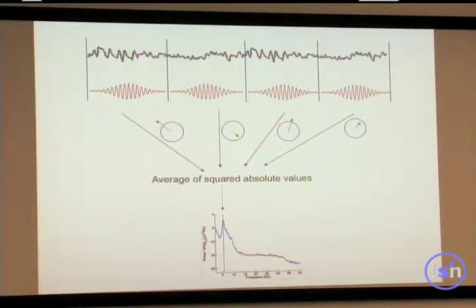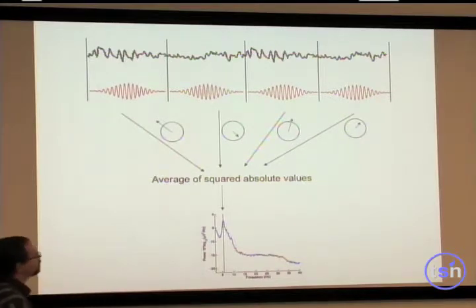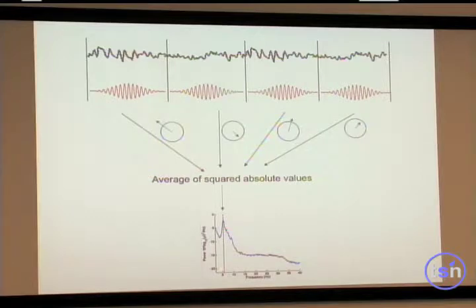And you're going to get this time frequency estimate. Here I just represented the real number. And I get a time frequency estimate for this window at a given frequency. Then I get a time frequency estimate for this window at the same frequency, this window, this window, et cetera. Then I'm going to average the square values of the length. And this is going to give me my power at this specific frequency.